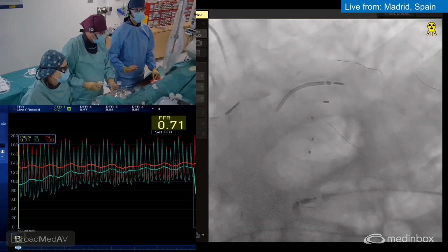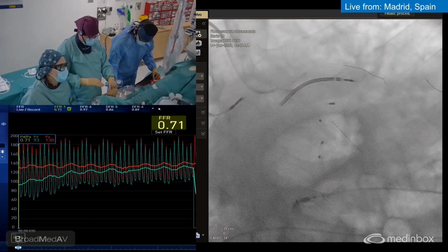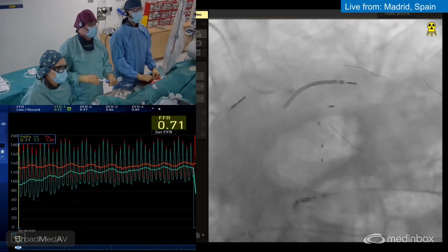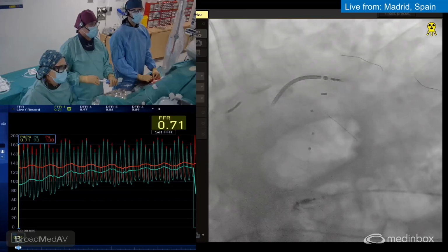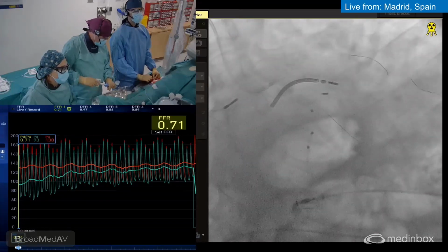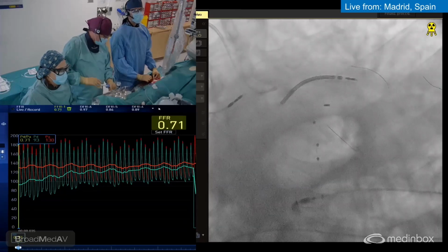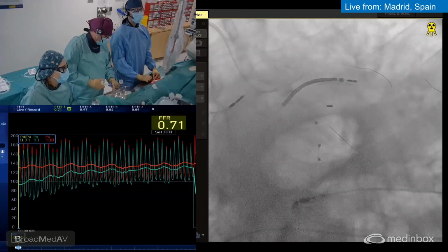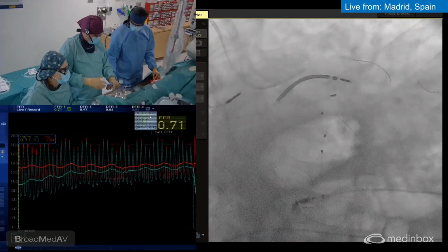Ok. 18. Ok, go down. Y hay que darle un poco más atrás, porque estamos un poquito dentro. The problem is to damage the circ as well with these dilatations. I don't think so, but vale, más proximal. If you have seen the IVUS, probably we have 5 millimeters or so in the left main. Okay, down.